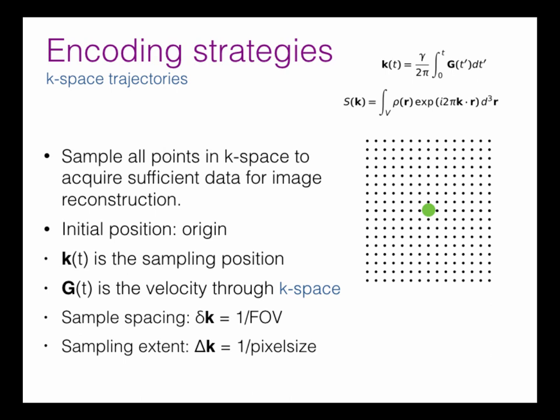If we have a bigger gradient, we're zipping along here. If we have a slow gradient, we're taking it slowly. If we apply a gradient in X, we go this way. If we apply a gradient in Y, we go that way. And if I apply my gradient in Z, I'd be coming right out of the board at you.